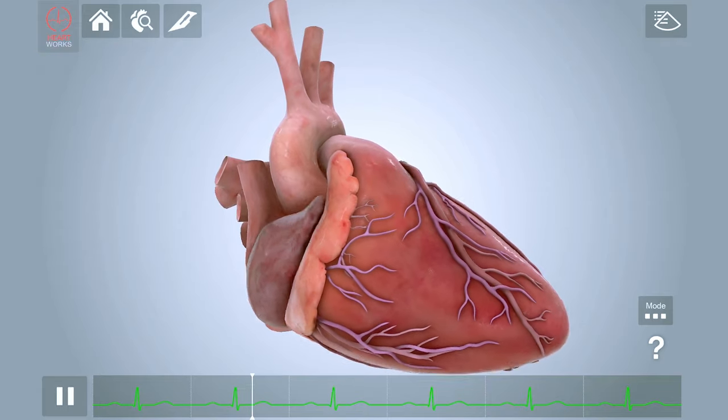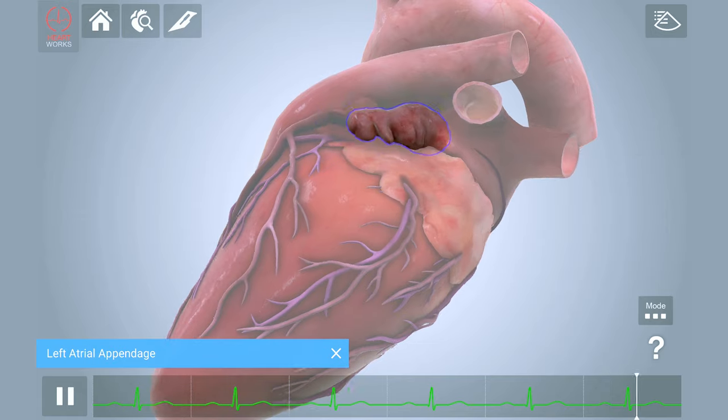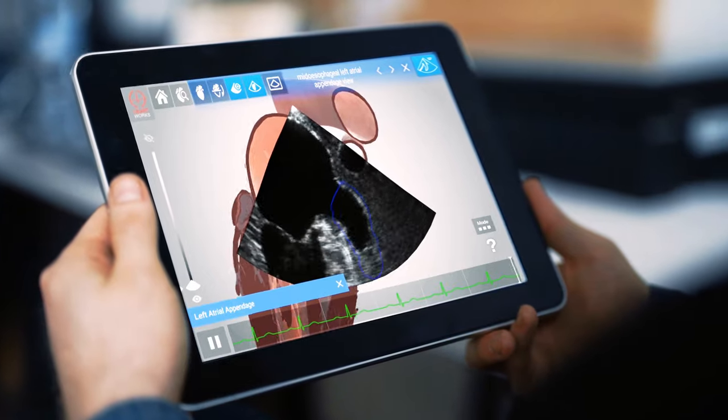HeartWorks Augmented Reality is a highly portable solution with the fidelity of the HeartWorks simulator preloaded onto a Samsung tablet. With HeartWorks AR, you can now learn cardiac anatomy and ultrasound anywhere.